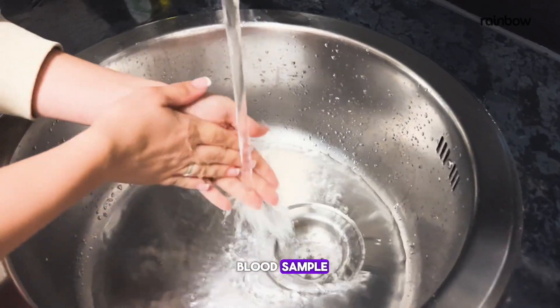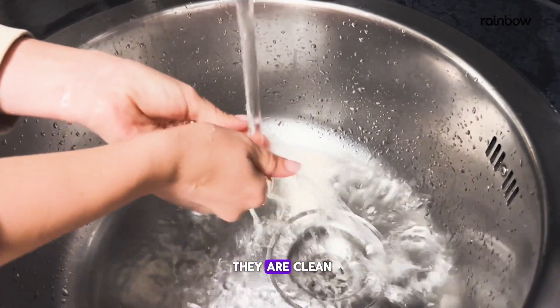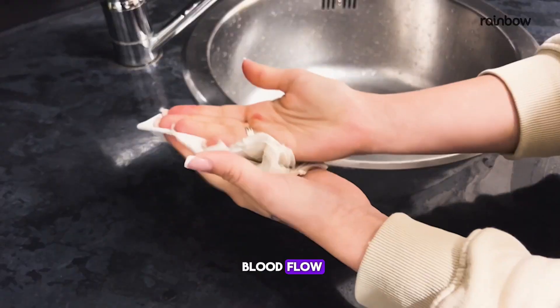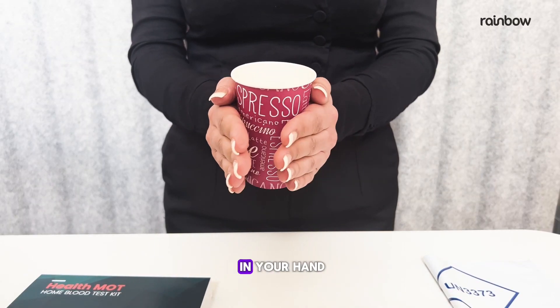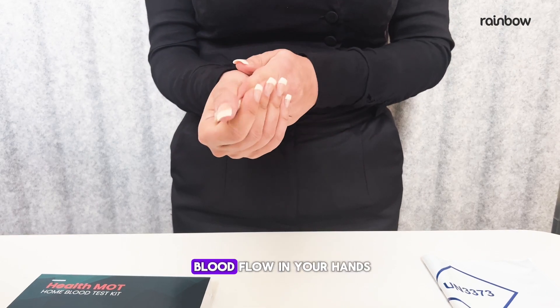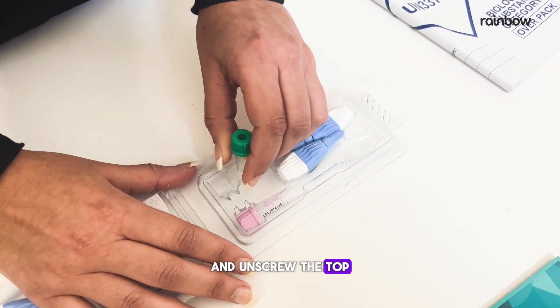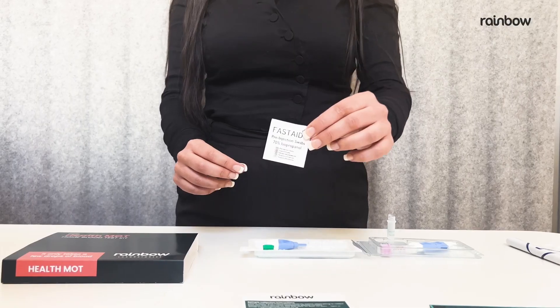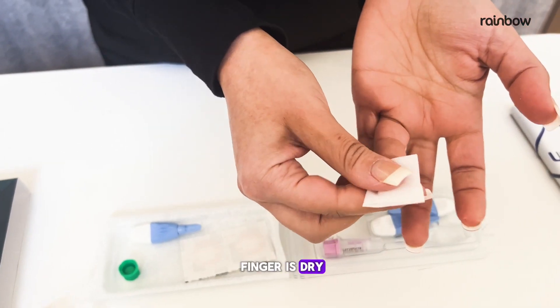Now let's take your blood sample. Begin by washing your hands in warm soapy water to ensure they are clean and to help with blood flow. Make sure they are completely dry. You could hold a cup of warm drink in your hand to help with circulation. Gently massage to encourage blood flow in your hands. Place the tube upright in the plastic wallet and unscrew the top. Clean the chosen finger with the alcohol swab and wait until the finger is dry.